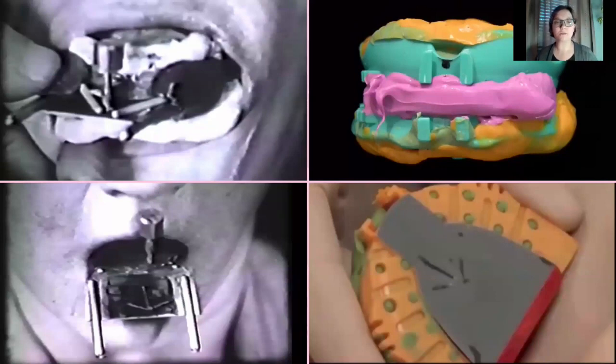So while we think about digital dentures as something brand new, none of the aspects of digital dentures and none of the physical characteristics and the steps are something that we just pulled out of thin air. Everything is based on landmarks and physiology and history and all of this evidence base that we've been working on for the last 120 years. So I just think this is so exciting, and to see this side by side showing this innovative workflow that works with printed dentures and CAD design compared to Dr. Giese in 1920. And so 100 years later, we're utilizing these same concepts, but in a way that's more user-friendly and streamlined for private practice.